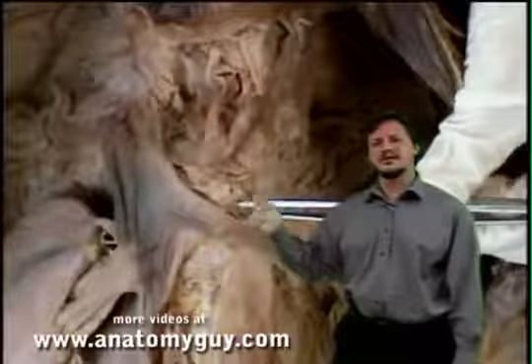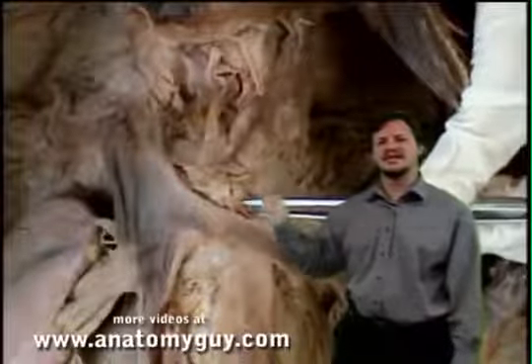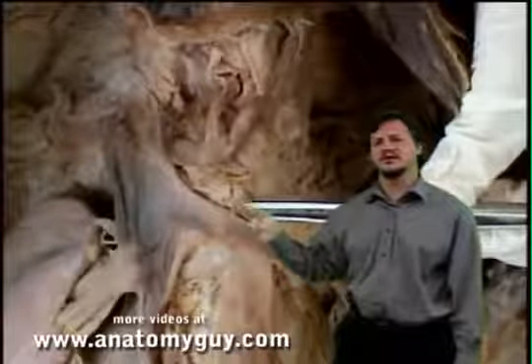Then, immediately below that, we have the superior mesenteric. And right in here, we can see the celiac ganglia that would supply some of the sympathetic autonomics to the area.